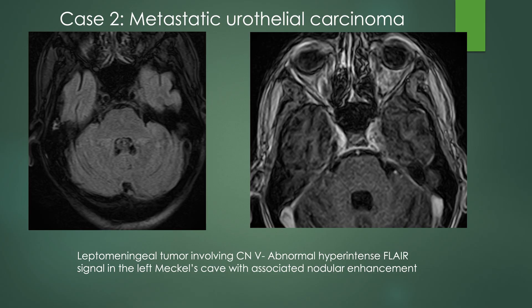Case two: this is metastatic urothelial carcinoma. Looking at the FLAIR on the left side of the image, you're looking for any abnormal hyperintensity where it's not supposed to be. There is bright signal within Meckel's cave, which should just be filled with CSF — cranial nerve 5 is traversing through there. On the post-contrast images, you see nodular enhancement within Meckel's cave along cranial nerve 5. This is leptomeningeal spread of metastatic urothelial carcinoma involving cranial nerve 5 in Meckel's cave.